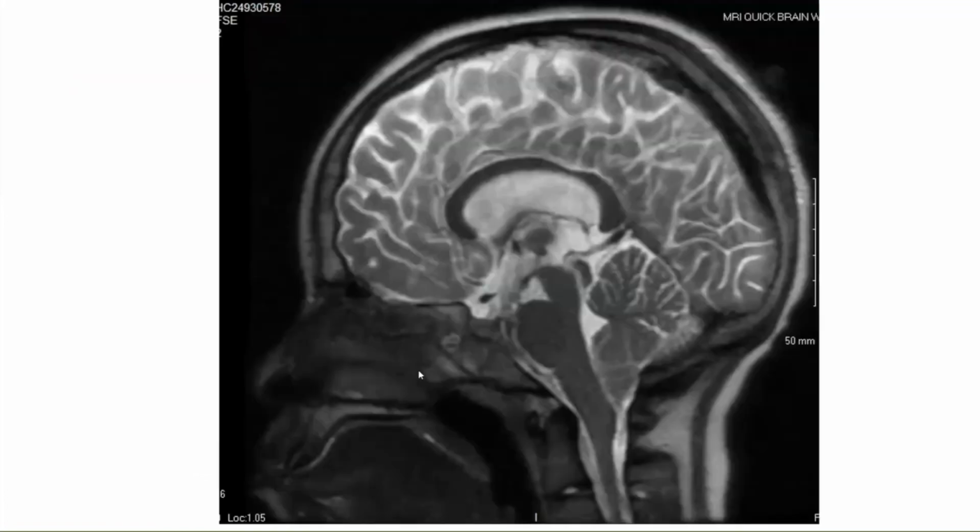So that's what we did. We did an ETV on her, and interestingly enough, I tried looking around. I used a single burr hole. The ventricles were large enough, and I thought with a flexible endoscope I should be able to reach back into the aqueduct. The floor of the third ventricle looked pristine around the anterior region. So very cautiously, after rechecking with stealth, I took a couple of bites, which looked to be completely normal ependymal surface. I'm glad I stopped there, because those biopsy results came back as normal ependymal lining.